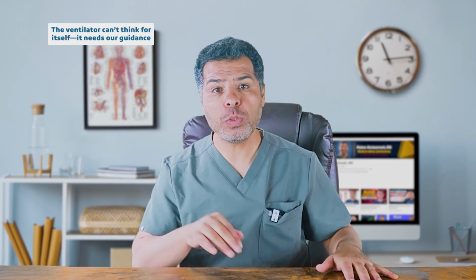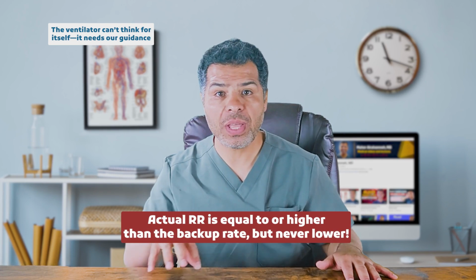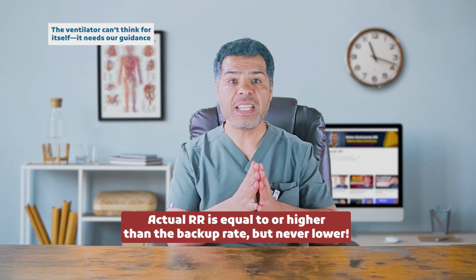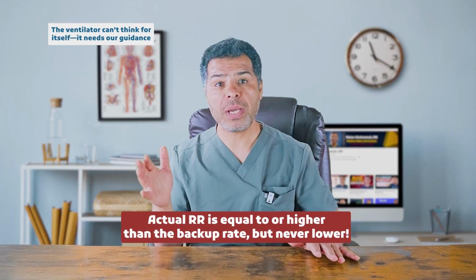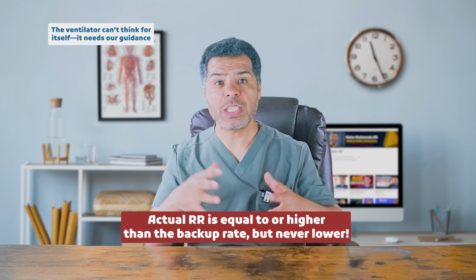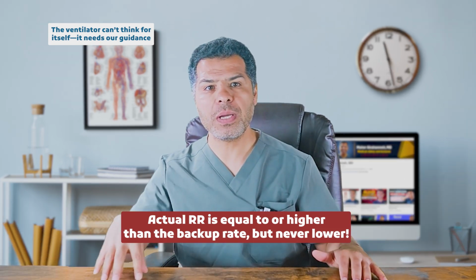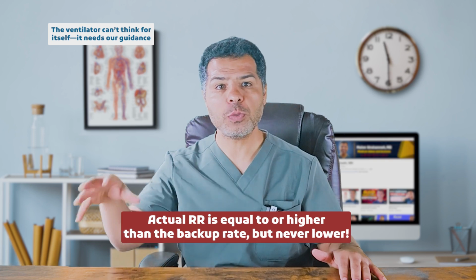It's important to notice here that the actual respiratory rate can be equal to or higher than the backup rate, but never lower. This is important when trying to adjust the backup rate. Let's say the backup rate is 14 and the patient is breathing at 20 breaths per minute. This is the actual rate. There is no point in increasing the backup rate to 16 because the patient's actual respiratory rate is already higher.